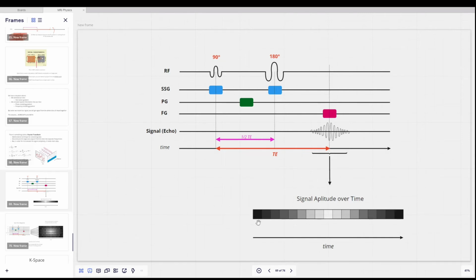Now you can tell the machine, hey, I want you to sample more frequently. Instead of the 17 boxes that we have here, let's do this 256 times. You would be able to get a much better idea of what your signal actually looks like the more that you sample. Here, if you were going to try to reconstruct what the signal looks like with only a few time points, it's going to be more rudimentary.